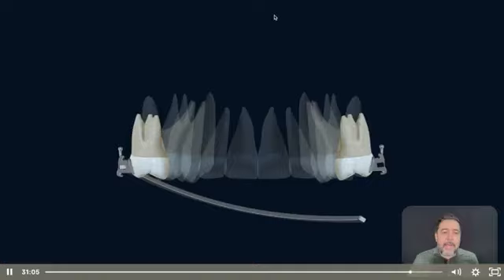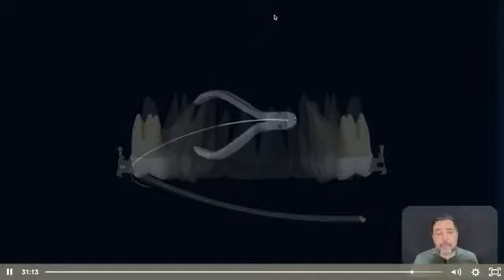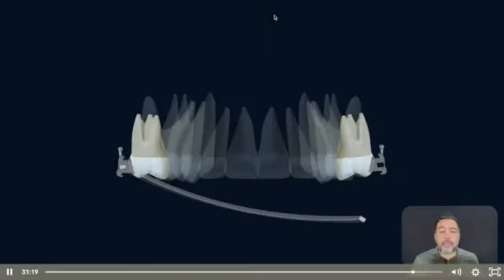So when I apply this torque and I'm putting the other tip of the wire inside the slot, the same way we do the measurement, we assess the real torque in the pliers, and when we go to the real thing, to the real environment, to a patient's mouth, and we check position in one side and we check the other side, we see something like this.